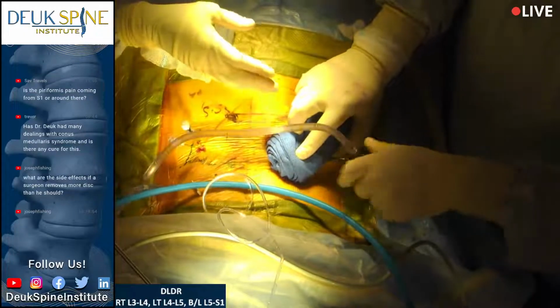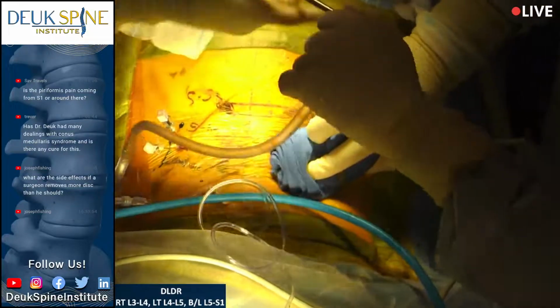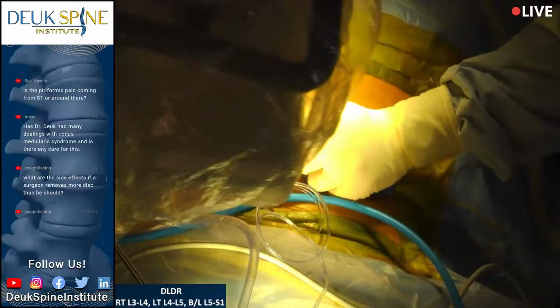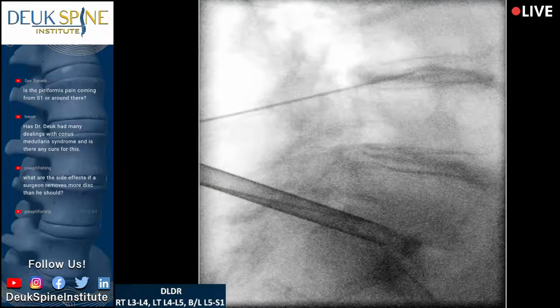And the reason it's tough to get out is the space that we have to navigate through is extremely narrow. I have to navigate that needle and tube through a space between the transverse process, the facet joint at L5-S1, the sacrum, and the iliac crest. All of those bony structures are bigger than normal because of arthritis at the joints. The arthritis makes the joints enlarge over time. They can get to be 2 or 3 times bigger than normal. I've seen that, sometimes even bigger. And when the joints get bigger, it makes the passageway for me to get down there even more narrow.